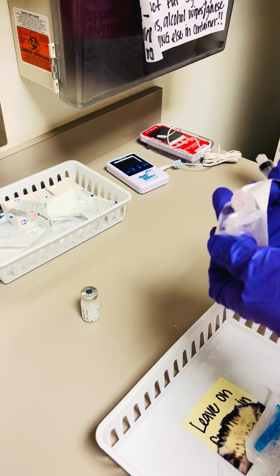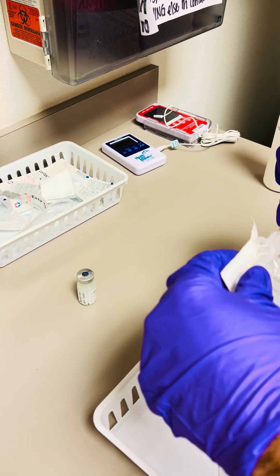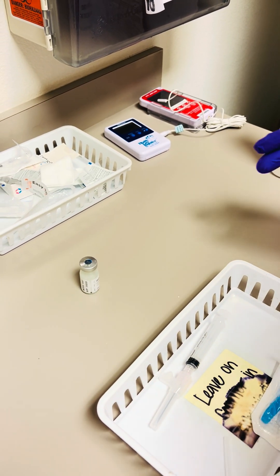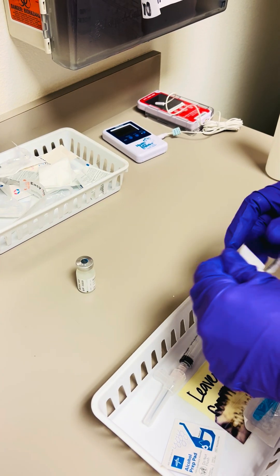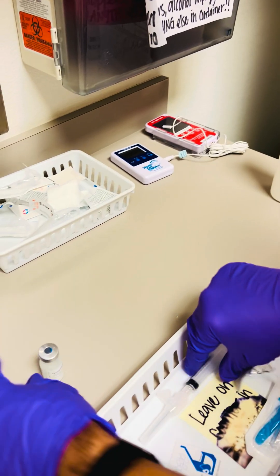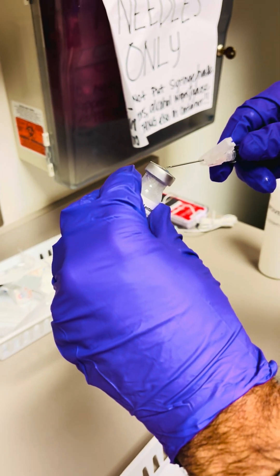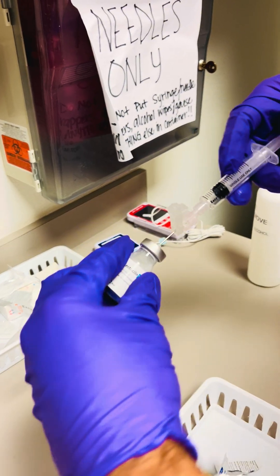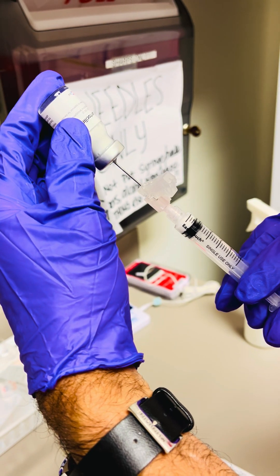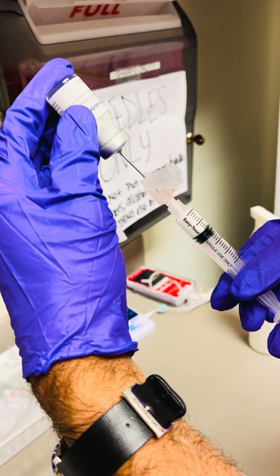Now prepare the syringe to draw up the solution with a new 18 gauge needle and draw up the entire contents into the 5 ml syringe.